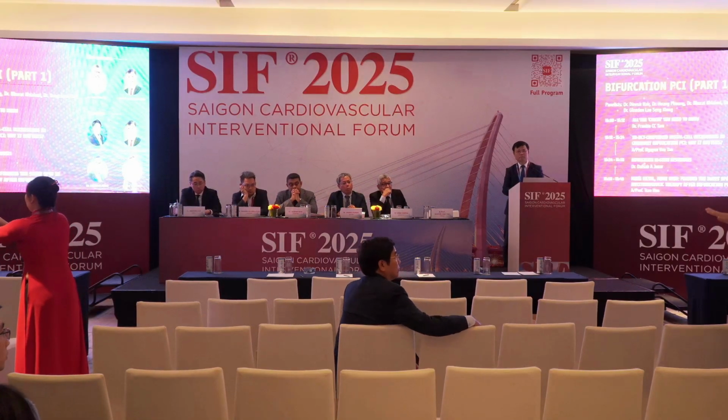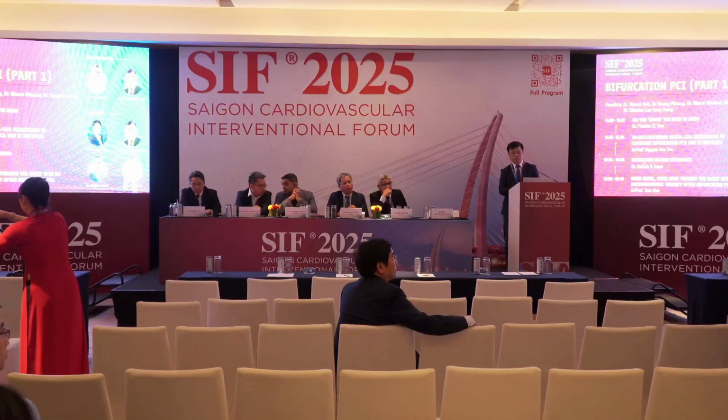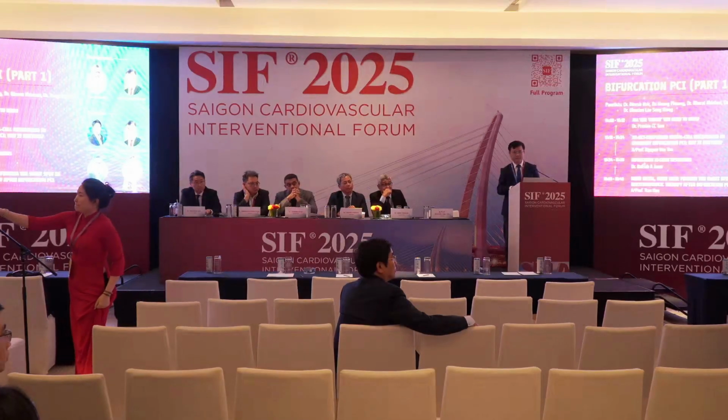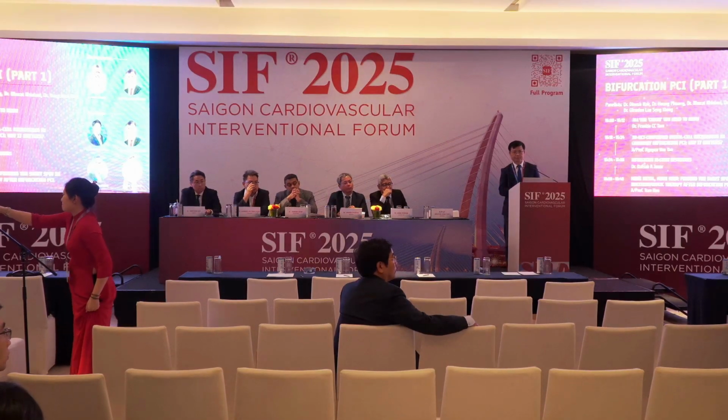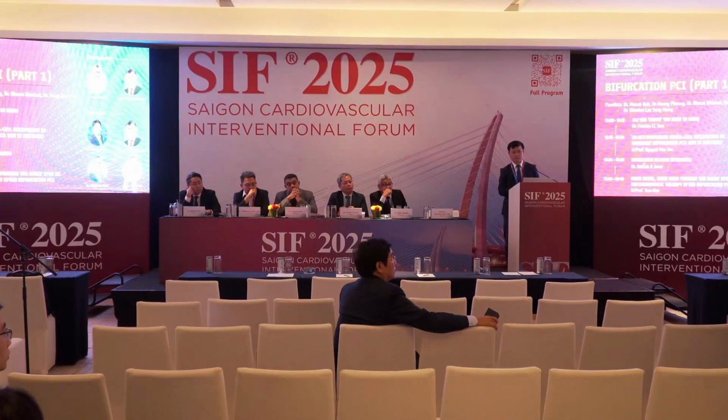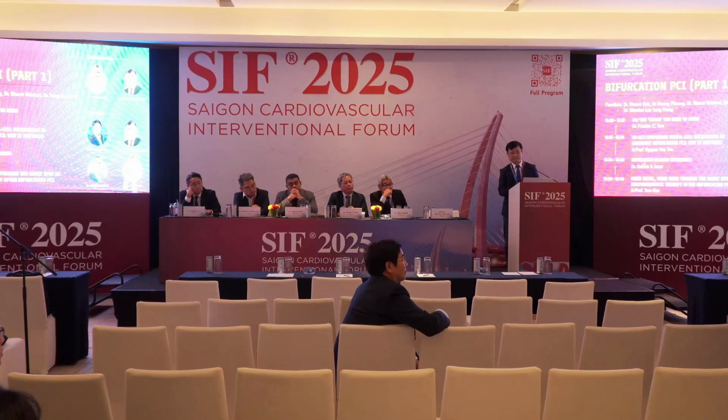Some cases are optimal, some cases suboptimal. How do we reduce the suboptimal procedures? I think distal wiring is the best one. When we do distal wiring, all cases are perfect? No, it must be validated by OCT. What I mean is that 3D OCT and the unfolded view show you clearly how much strut crossover there is at the side branch ostium. His presentation very excellently showed what we did in the two-stent technique, especially in the bifurcation region. I really enjoyed your presentation.